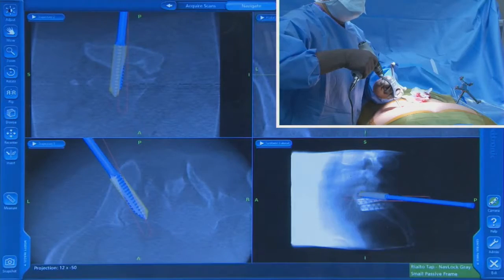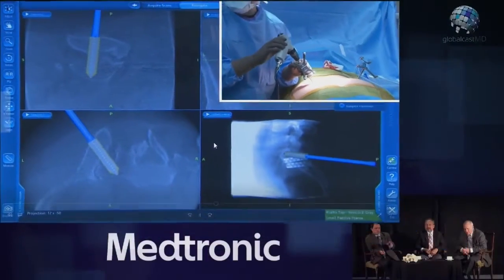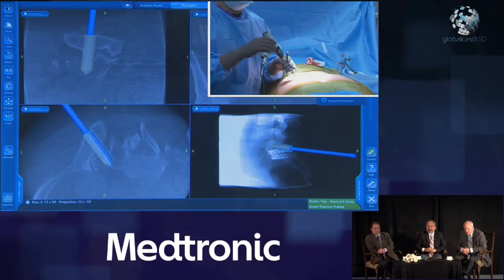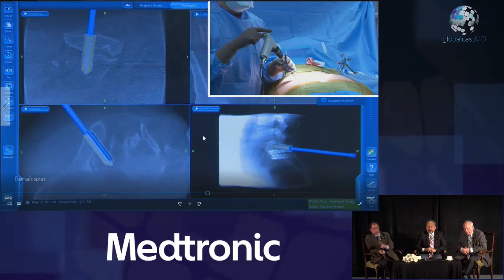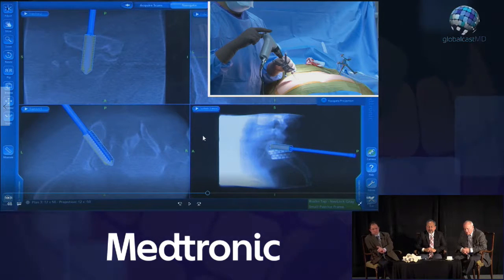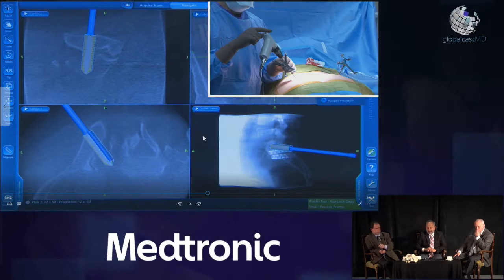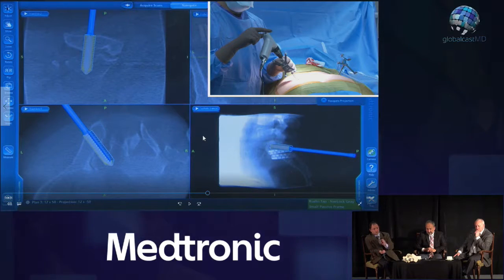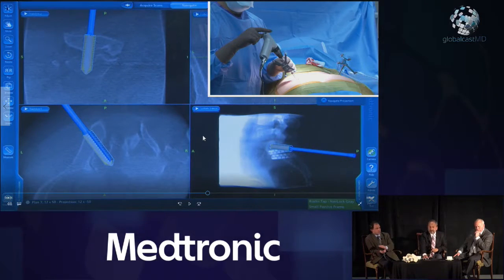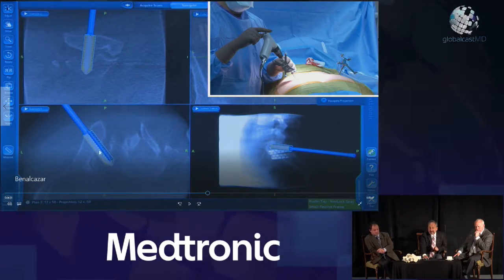One thing worth pointing out is that the fourth cortex — the ventral cortex of the sacroiliac — is very thin. If there is a risk in this procedure, it's plunging into the pelvis, and that's why the system comes with very robust depth stops. You must use the depth stop because the ventral fourth cortex is one you never want to go through — and nevertheless, you're still going to feel that.